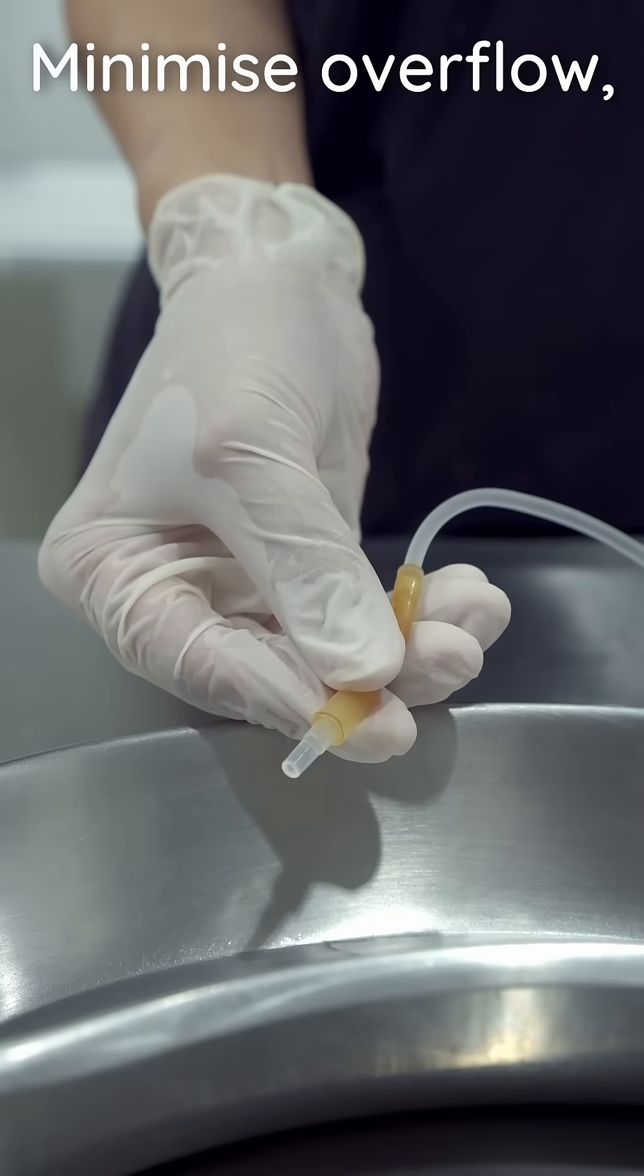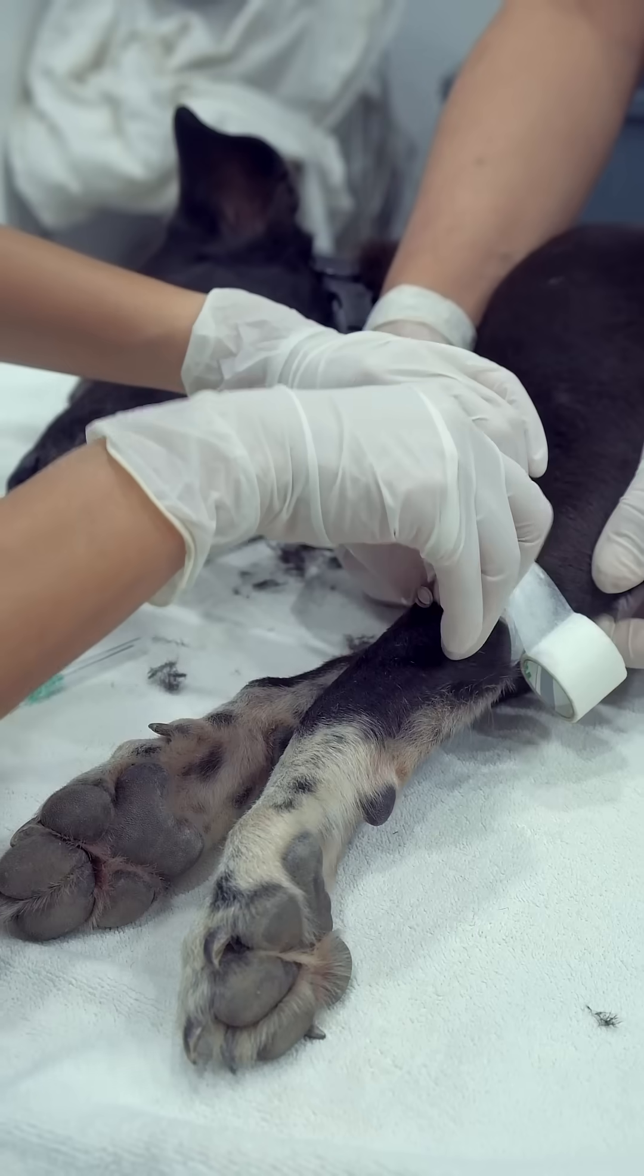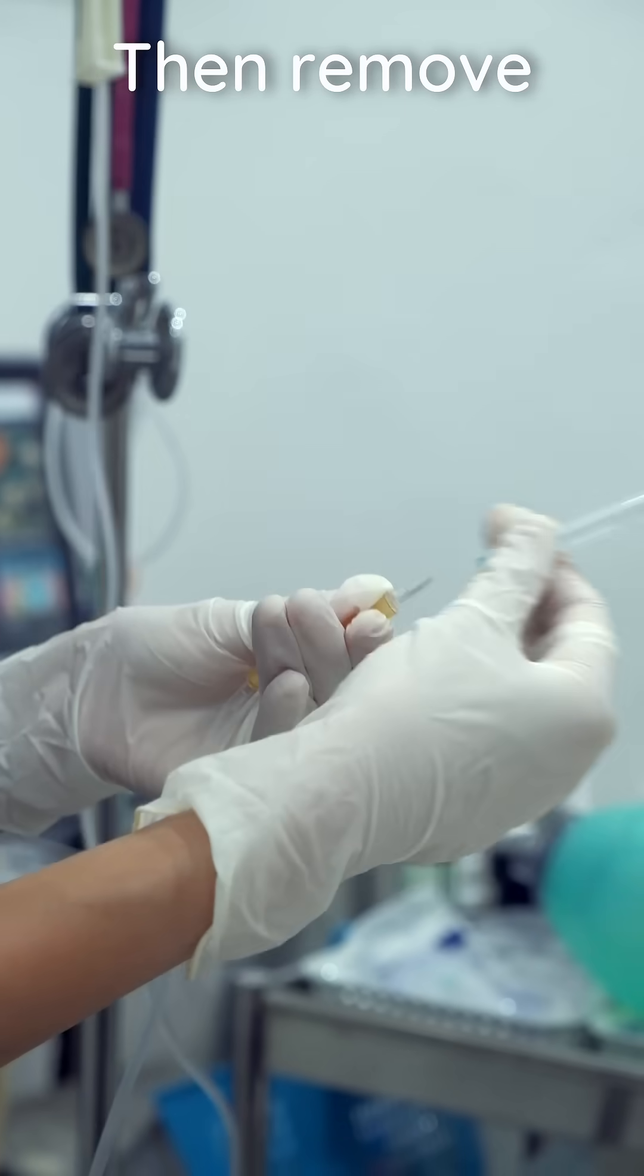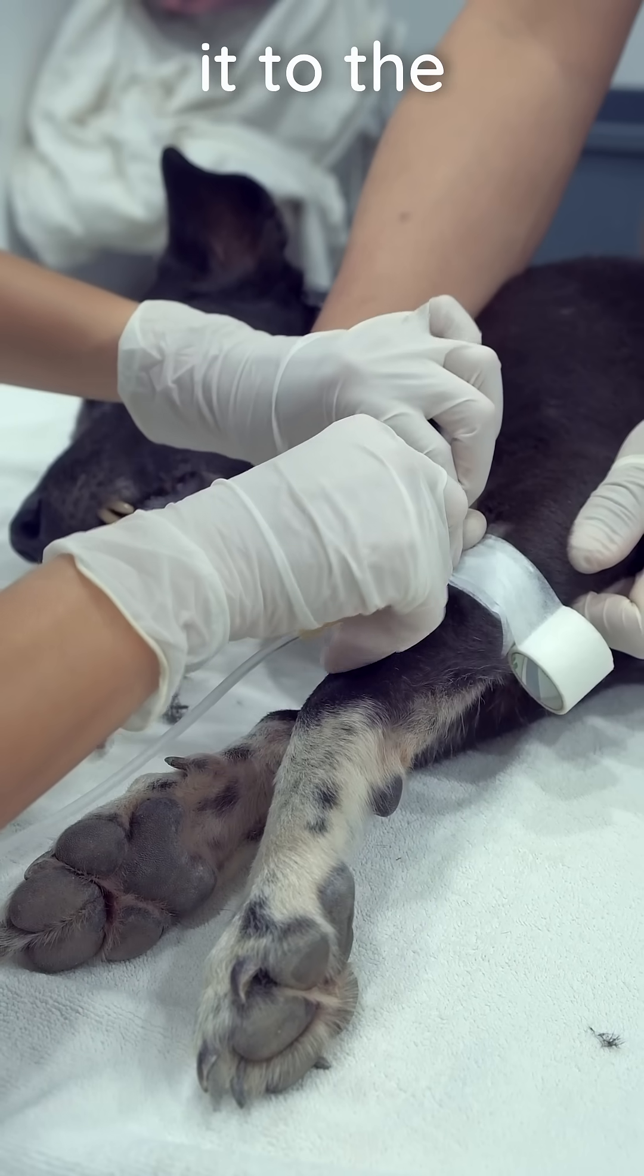Aim to minimize overflow, but some can be caught in a small bowl. Prep the patient's catheter, then remove the set's protective cap and connect it to the catheter.